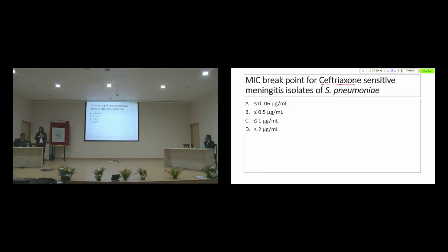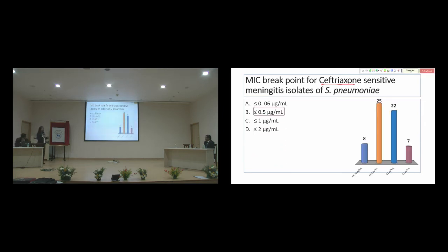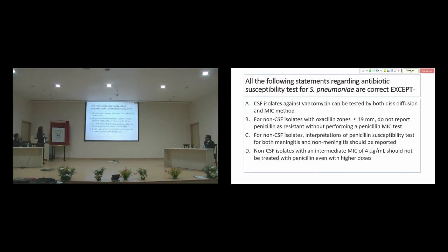Question is different, okay. Yeah, actually, as I told earlier, to remember all this is humanly not possible, but there are few things which are expected out of us to remember, and this is one among them. So what is the answer here? It is 0.5. So after this, I'll show you a table of breakpoints for Streptococcus pneumoniae.